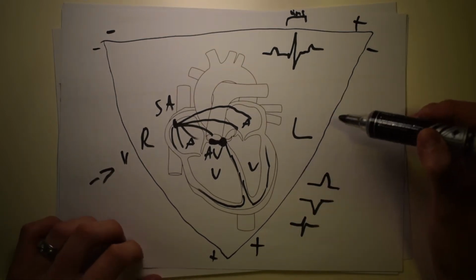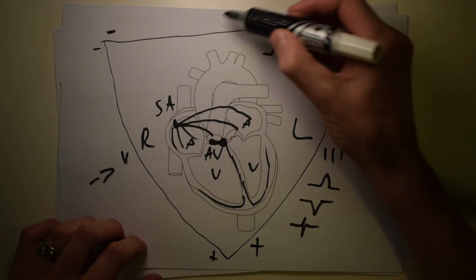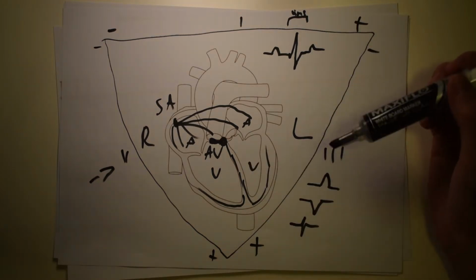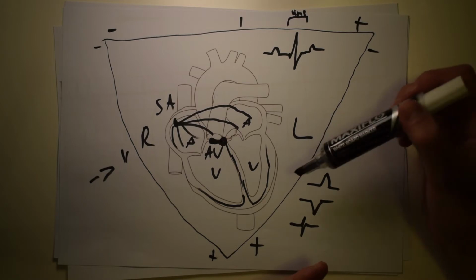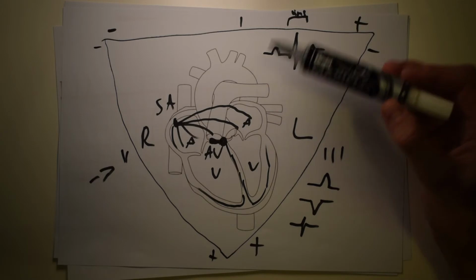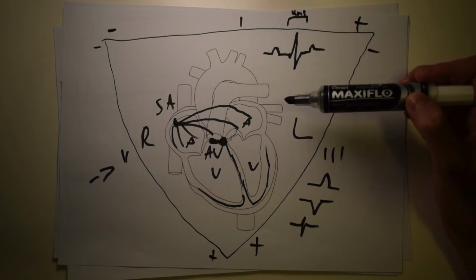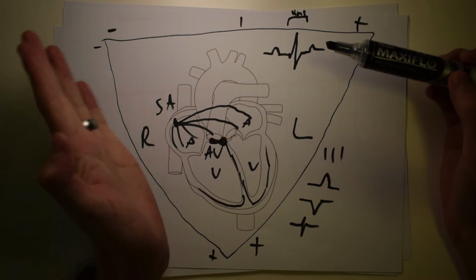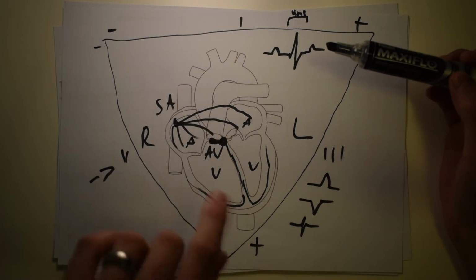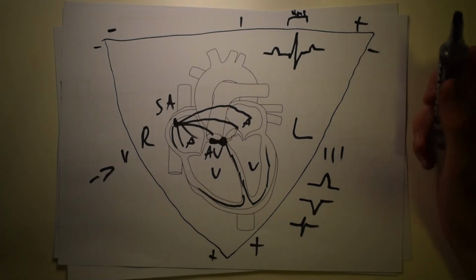That isn't really important for you right now, but this would be the view of lead 3, and this would be the view of lead 1. If you're looking at an ECG machine, you'll have the option of choosing lead 2, lead 3 or lead 1. So that's a basic 3-lead ECG. When you look from different leads, you'll see slightly different positive or negative lines, depending on which direction it's moving in correlation to where you're looking. That's why we typically look at lead 2: it goes down the side of the heart, and we are able to see better what movement is showing with what.